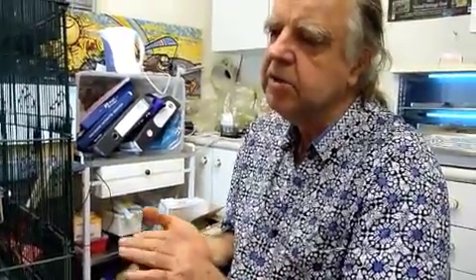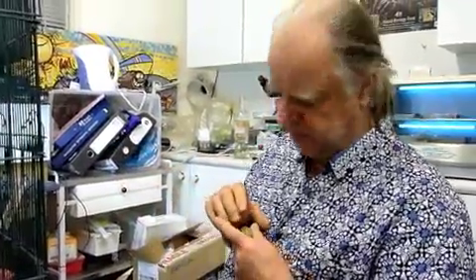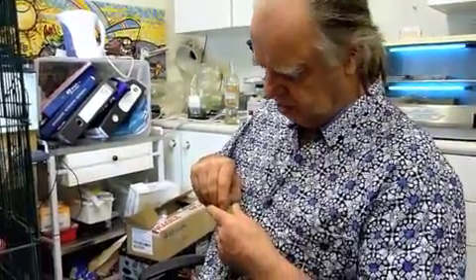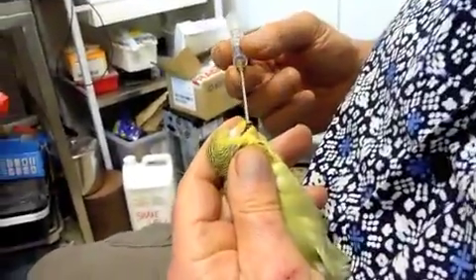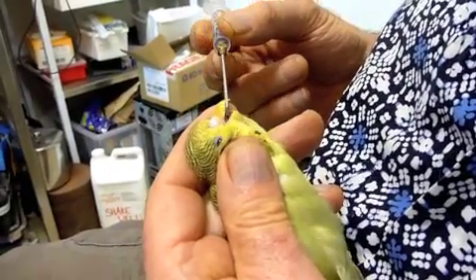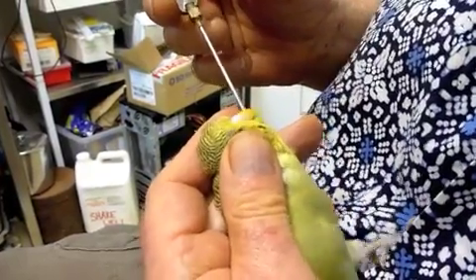Now I'm changing my grip and starting to position the little budgerigar so that I've got full control of the head and neck, because I want to keep the neck straight and the head straight. I'm still extending love to her, but I'm having to hold her more firmly. I've got the head rotated back, secured between thumb and fingers. I'm putting the end of the tube over the tongue — when she puts the tongue forward, I line it up with the neck.